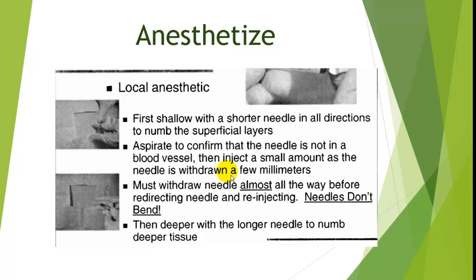Knowing where you're going to put the needle, you first do your local anesthetic. I usually only put in a small amount of lidocaine subcutaneously, thinking that I'm probably going to cause as much or more pain by giving more anesthetic as I will after the subcutaneous and cutaneous area is anesthetized.